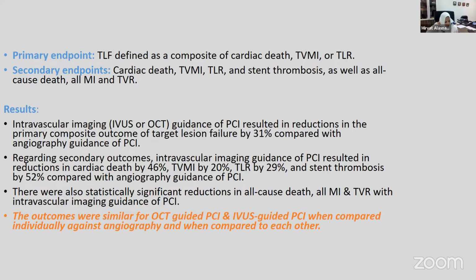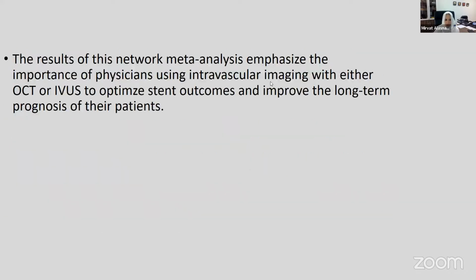Absolutely. So I'll comment on the PREVENT just very quickly. I'll finish this one off that Greg Stone had presented. And basically what it did show is that intravascular imaging, be it OCT or IVUS, compared with angio alone, is actually better than angio alone. So I think it emphasizes that you should get comfortable with an imaging modality, adopt it, use it. It's always going to be better than angiography alone.